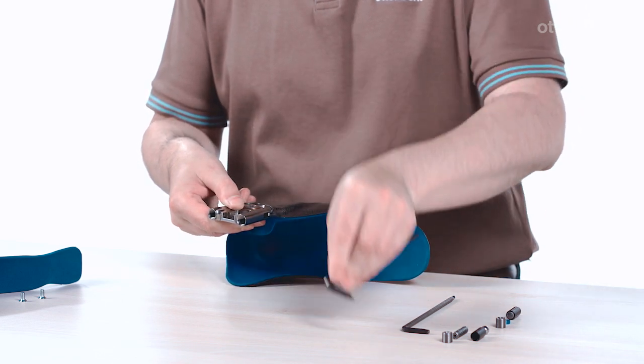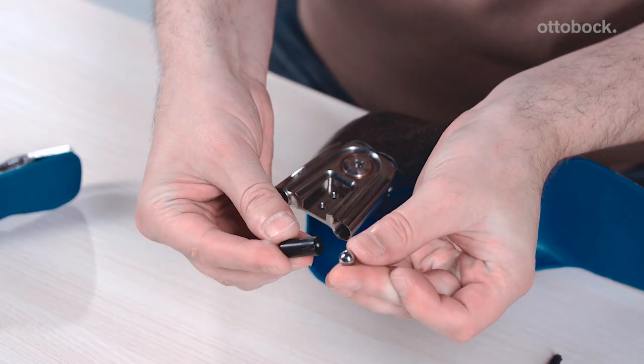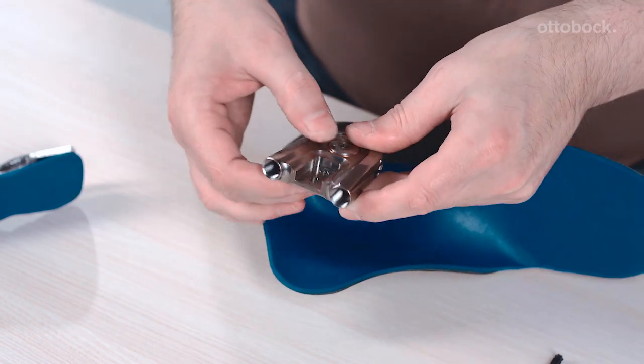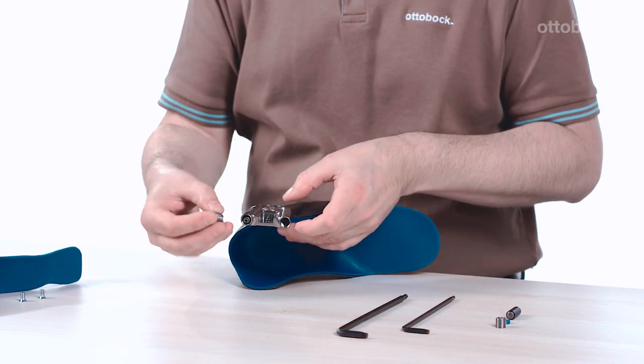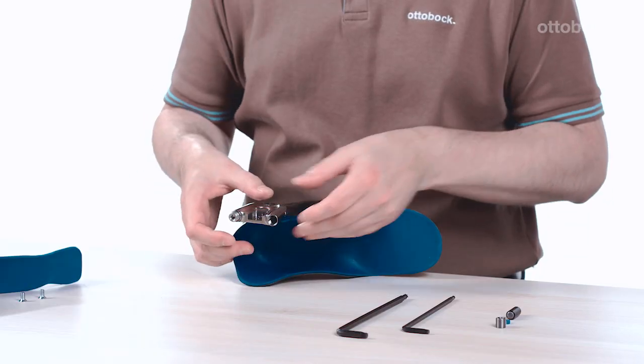Fit the spring and stop on the joint prior to installing the lower leg shell. The ball must be positioned in the receiver of the spring guide housing when installing the spring that lifts the foot. First, slide the ball together with the spring guide housing into the basic piece. Then install the spring and close the channel on the basic piece with the set screw.